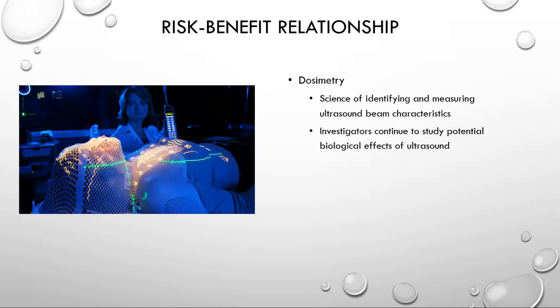So for the risk-benefit relationship, we utilize something called dosimetry. This is the science of identifying and measuring ultrasound beam characteristics. Investigators continue to study potential bioeffects of ultrasound, though to this point none have been found. A couple of important experimental terms need to be introduced.